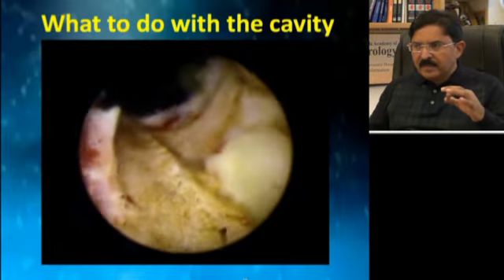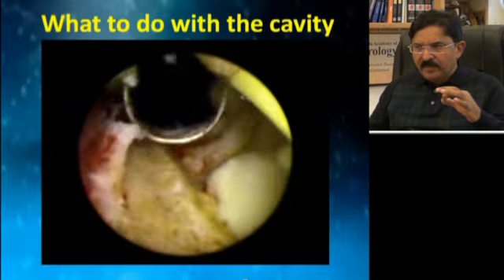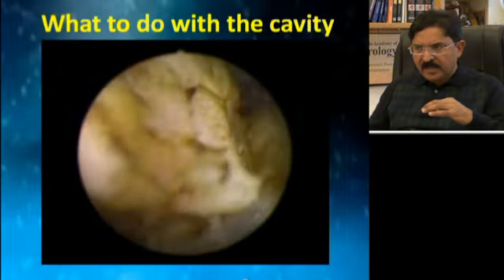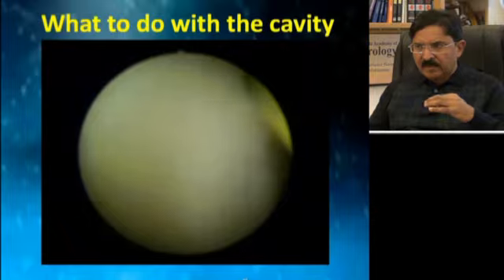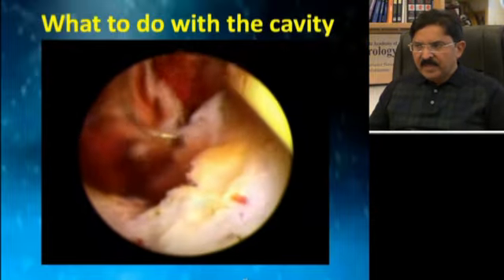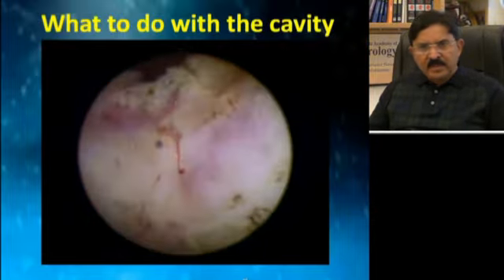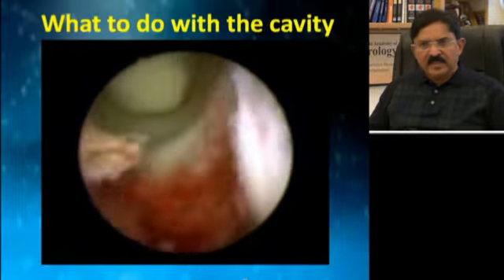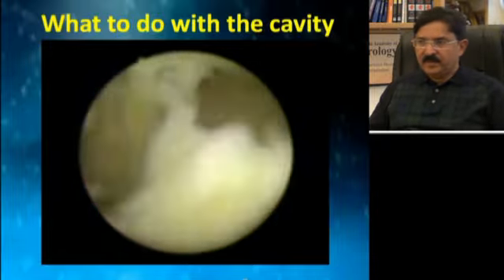And then you have to have an idea where all the abscess may be spreading out, and you cut by the side of the hole so that the pus can easily flow out. What I am saying is that the size of the hole that you make on top of the abscess cavity should be with a decapping kind of approach.